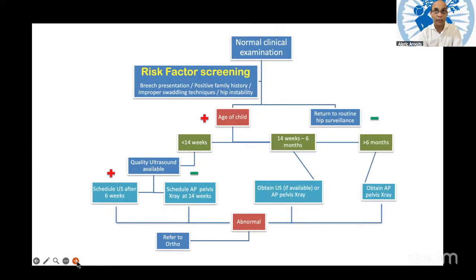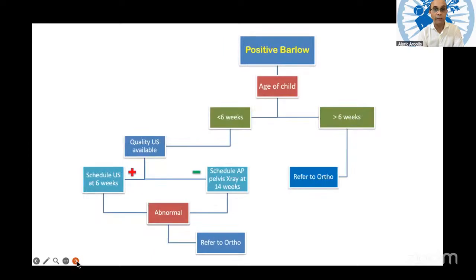I think this for us is a very important slide, because I think it brings down the fact that we don't need to always depend on the ultrasound. We can use the X-ray as a screening tool, because that is universally available in every single center in India.